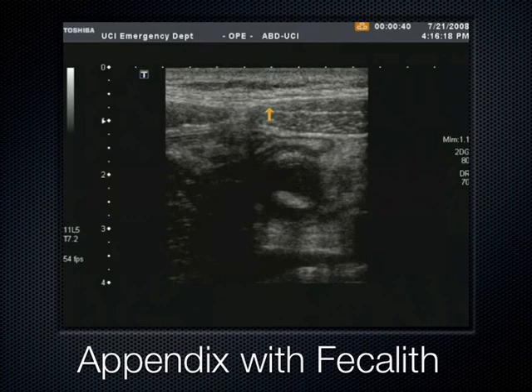There are risks that you can do to patients with ultrasound, such as dislodging a DVT. That does frighten me, but compressing an appendix, I don't think there's enough extrinsic pressure that you could perforate it. I think really the true perforation comes from the inside getting ready to make it pop. Yeah, we're pushing a lot of pressure, and maybe I oversold that too much. We're not pushing so hard that we're causing a very local part of it to perforate. We're pushing enough just to get the muscle bellies to come together.